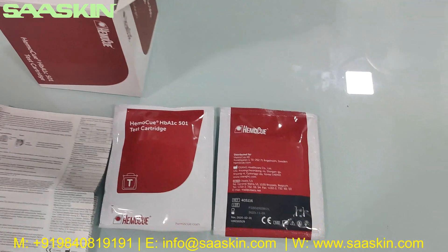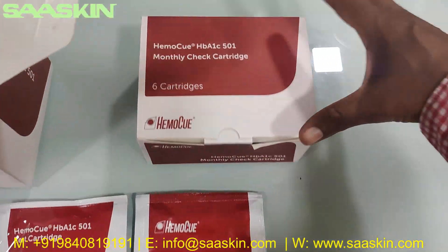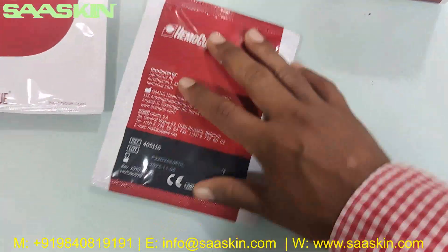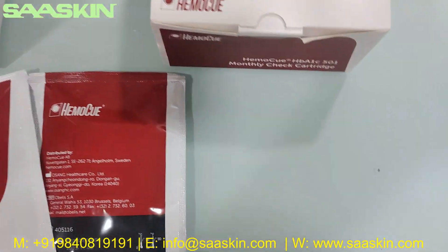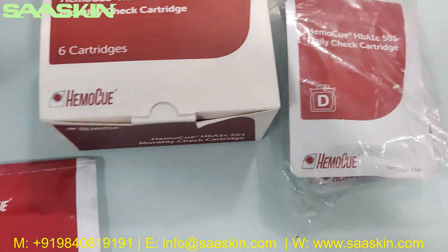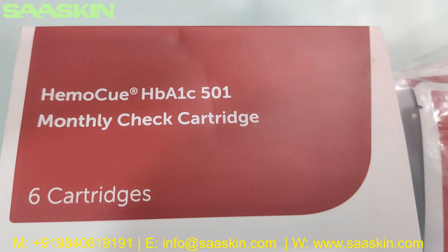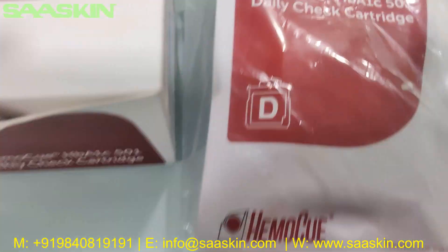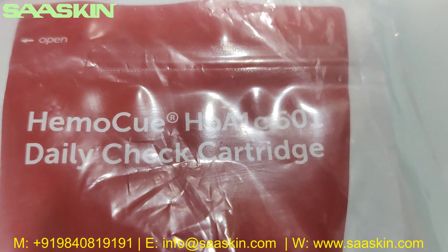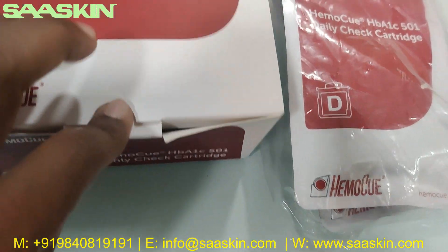Along with this, I'll also introduce the control cartridges for this machine. This is the control cartridges pack. You can see the EmoQ HbA1c 501 monthly check cartridges, and you also have the EmoQ HbA1c 501 daily check cartridge.